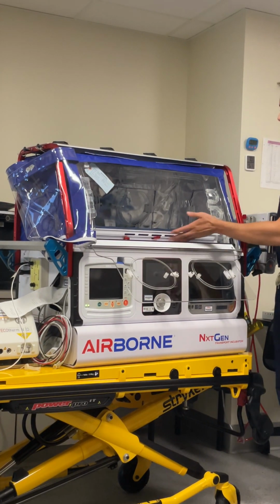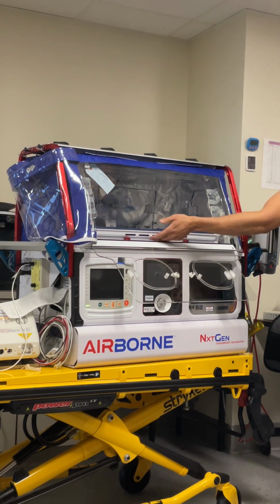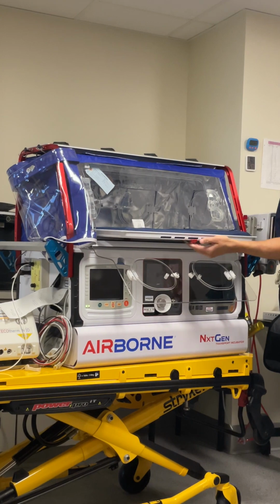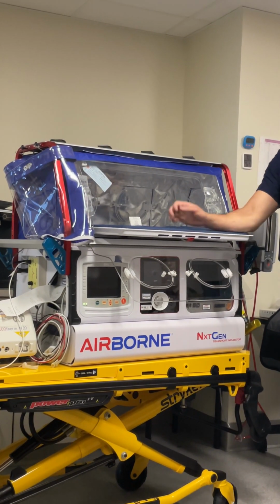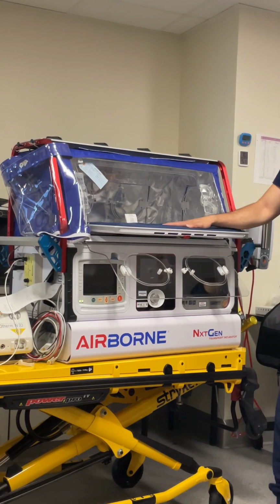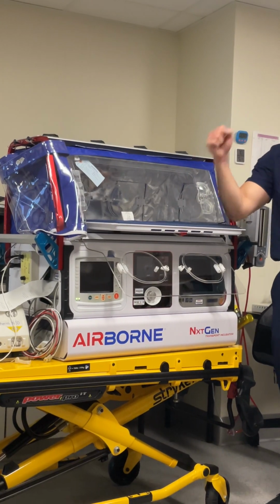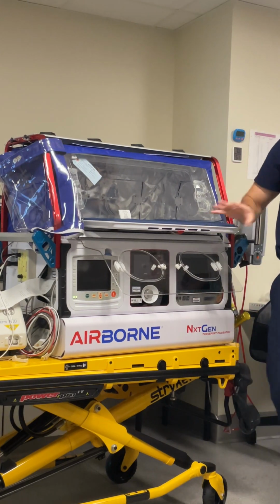Excellent. So now this tray, pull that red slide, it comes out halfway so we can get access. Someone's going to ask how much weight can go on here. Well, technically, I think in the manual it's 22 pounds. You'll never fit that patient in here. It's really a mount. Like, can I lay on here? No, right? There is a limit.